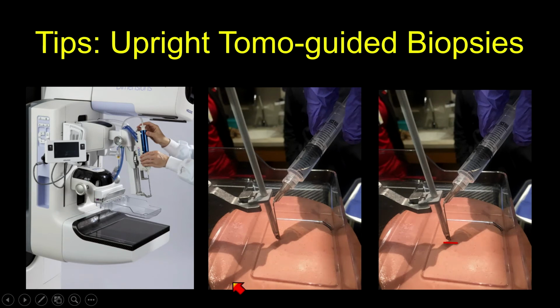So when you numb the tissue, it's good to numb along the expected trajectory of the needle instead of numbing vertically up and down. You numb along that track. Also, when you put a skin nick, instead of centering your nick right at the needle tip, you might want to bear it ever so slightly away from the needle tip. And that would actually allow more smooth insertion of the needle.